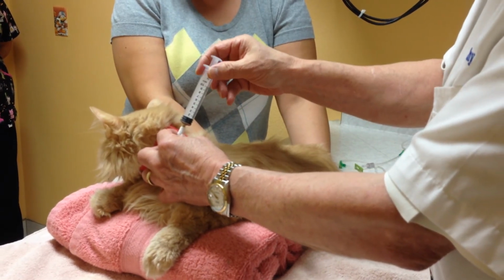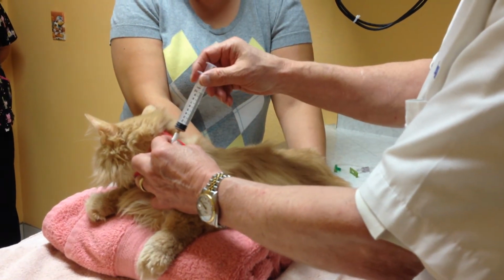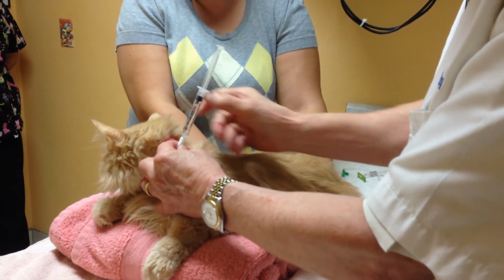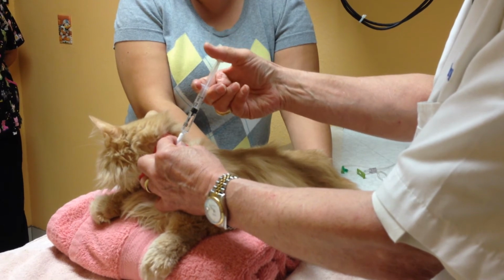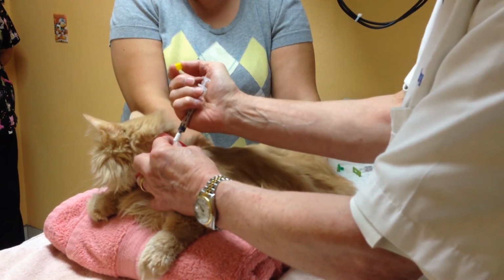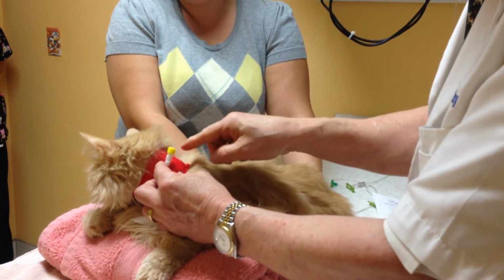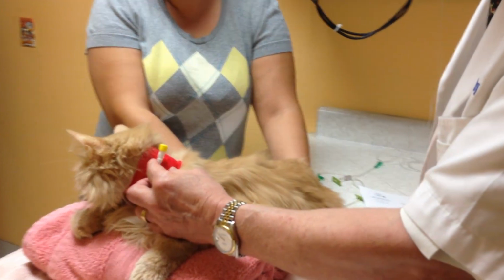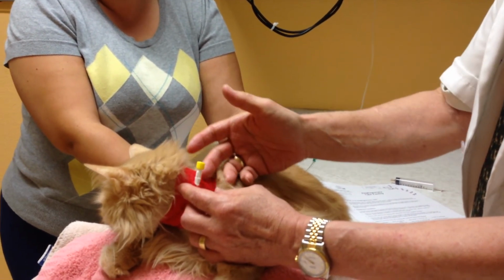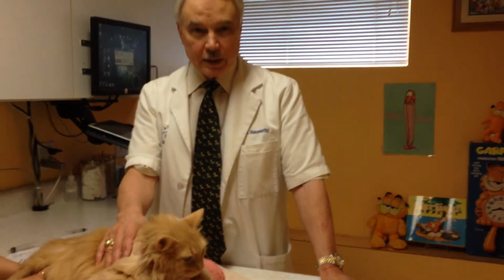When the last syringe has been administered, then we're going to flush the feeding tube with a syringe of tap water. This is a smaller syringe. This is simply tap water. You just flush it through, and that clears the food from the tube. Take the syringe off and put the cap on. You may have noticed the water tried to bubble back as soon as I pulled the syringe off, so you want to be sure to have the cap ready to go. If it does bubble back, you just simply take a tissue and clean it off. That completes the feeding process.